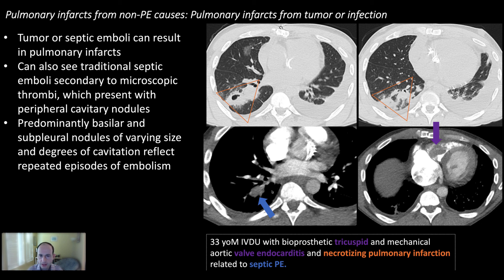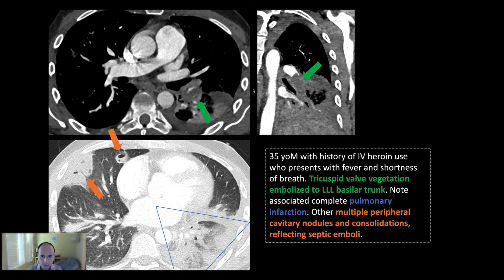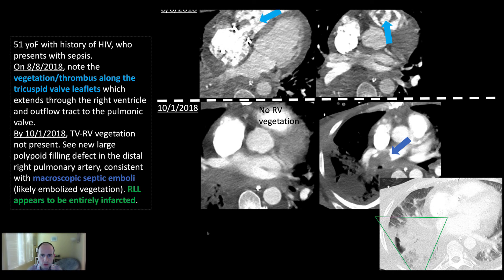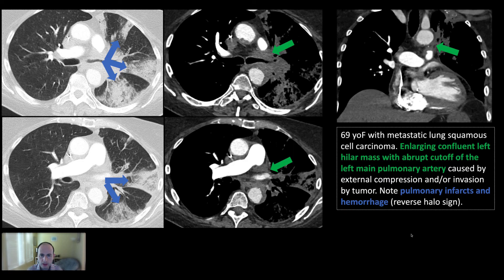Here is a case of pulmonary infarct caused by embolization of a septic embolus. You can see a large vegetation along the tricuspid valve, an embolus in the right lower lobe pulmonary artery with extensive surrounding inflammatory change. In another example, in the left lower lobe pulmonary artery with septic emboli, vegetation is seen along the tricuspid valve and main pulmonary artery, with subsequent embolization into the distal right pulmonary artery causing a large area of infarction.